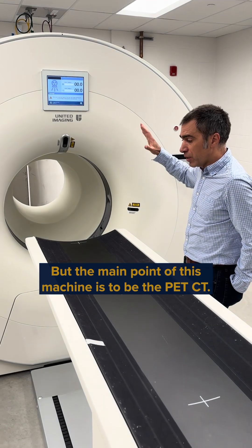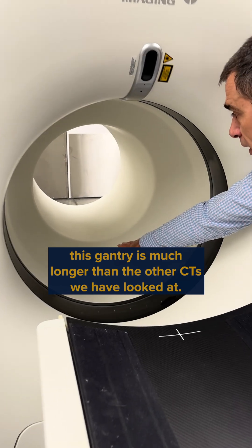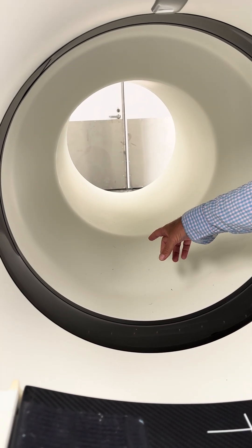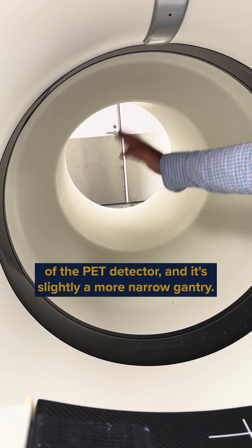The main point of this machine is to be a PET-CT. You can see that this gantry is much longer than the other CT we've looked at, and at the back over there, we have about a foot and a half of PET detectors.